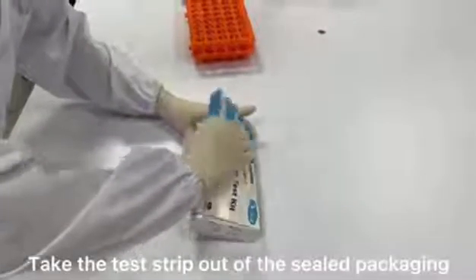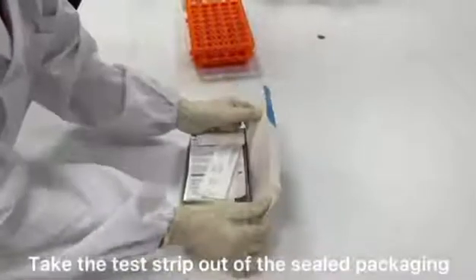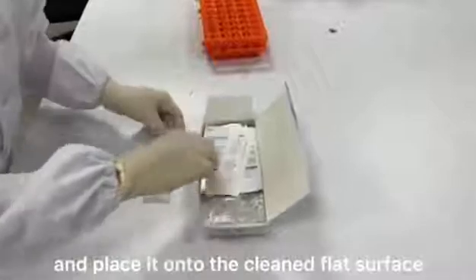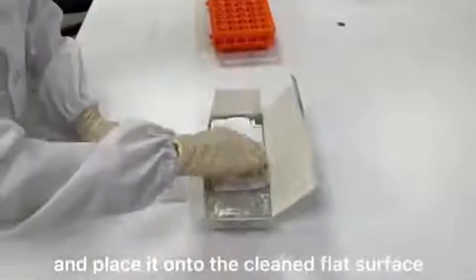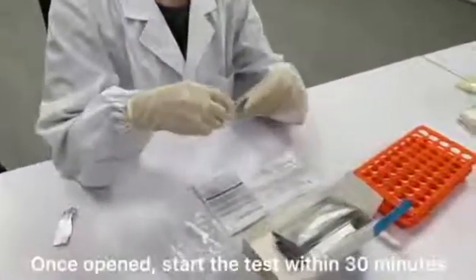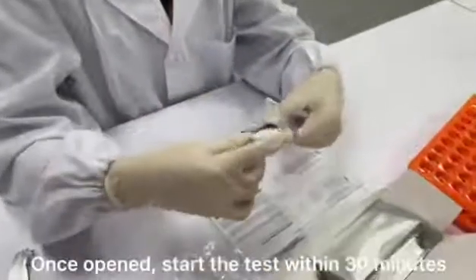Take the test strip out of the sealed packaging and place it onto a cleaned flat surface. Once opened, start the test within 30 minutes.